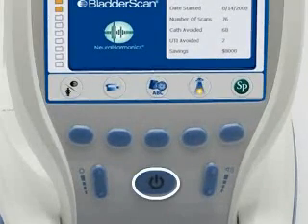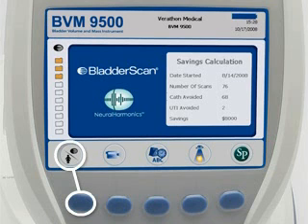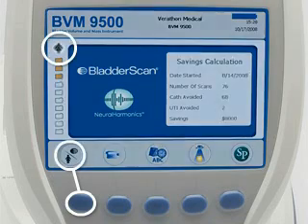Turn on the unit by pressing the power on-off button. To measure bladder volume, the BVM9500 is designed to scan in two patient-specific modes. Select the proper exam mode to ensure the accuracy of your scan. Press the button until the desired setting appears. Select to scan a male patient or a female patient who has had a hysterectomy. Select to scan a female patient who has not had a hysterectomy.